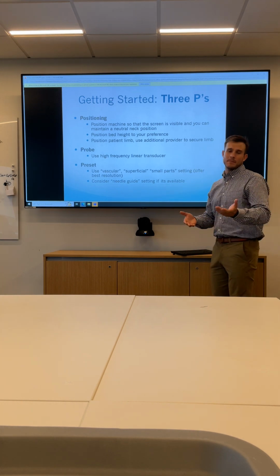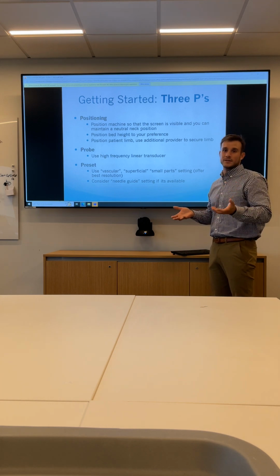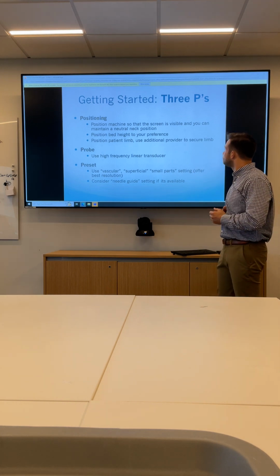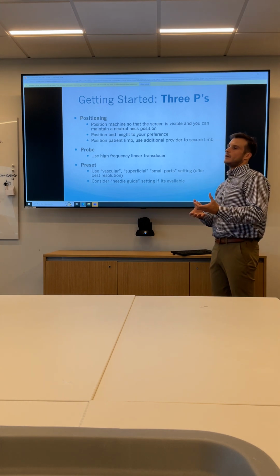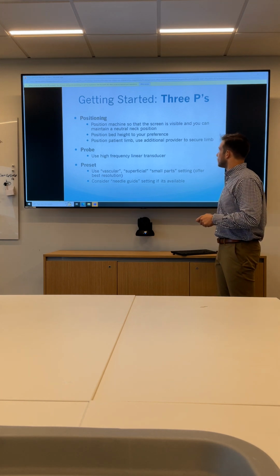Again, be mindful if the patient has an A-line, or CVP, or any other things that need to be leveled. When you bring that bed up, level, and then you can start to prep your patient. Then position the limb, whichever limb that you're sticking, in front of you, in a place that's easily reached and easily accessible.